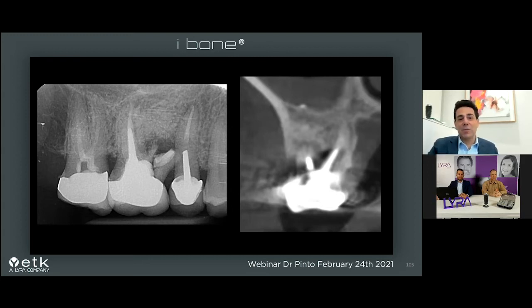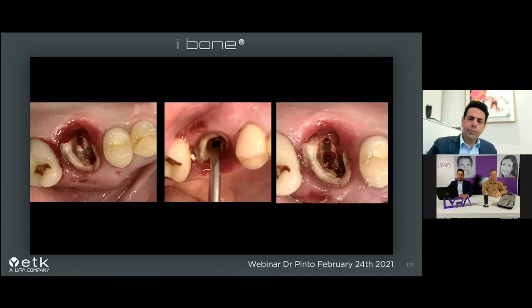She doesn't have work. She said, okay, but now I have time, but I don't want to wait a long time to remove the tooth and put the implant the second time. So we decided to do everything on the same day. Please excuse the quality of these pictures. We took them only with an iPhone, and it's not a very nice picture. You will see the other pictures after.